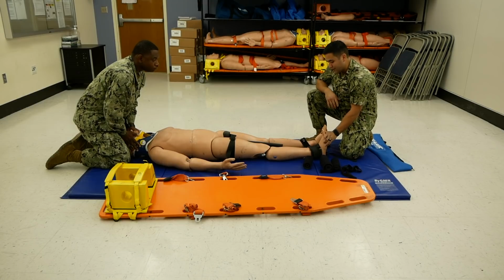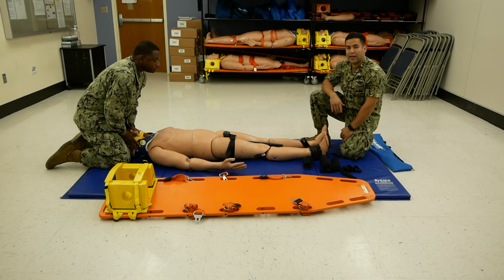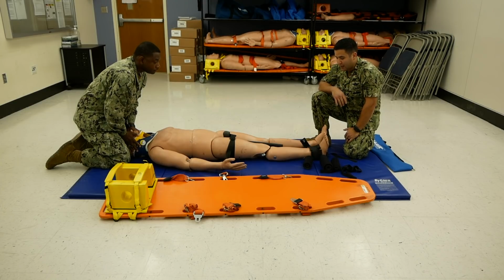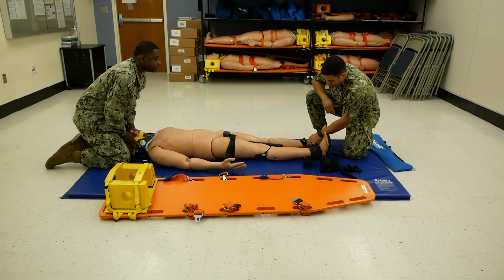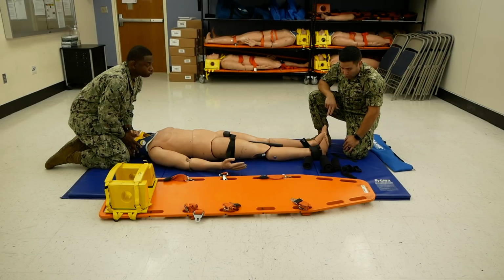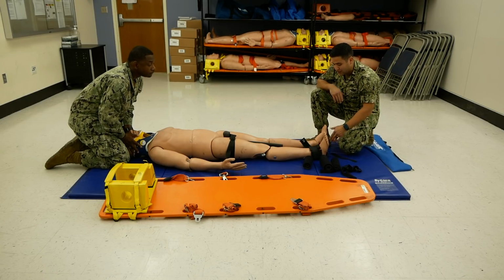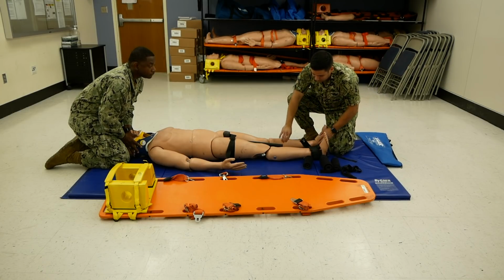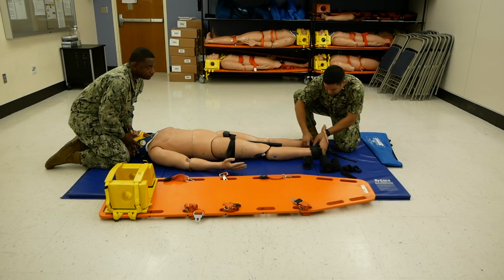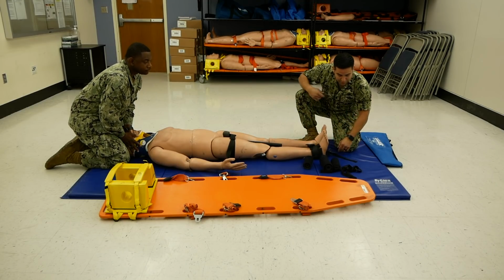Now that the traction splint has been secured, you want to go ahead and pull traction. You want to pull about 10% of the patient's body weight; for the lab, let's say between 10 and 15 pounds. There are 2 sets of numbers. The black numbers are pounds, red numbers are kilograms. You want to make sure you say 10 to 15 pounds. Secure the upper portion of the shaft as you pull on the lever. And pull to 10 to 15 pounds.